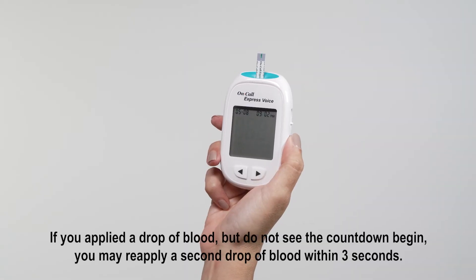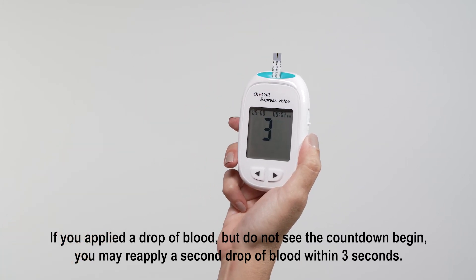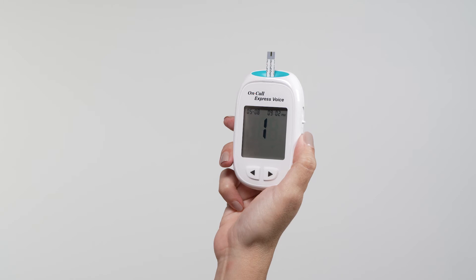Touch the blood sample to the sample tip at the end of the test strip. If the volume is greater than zero, the meter will beep to indicate the sample is sufficient and ready to test.